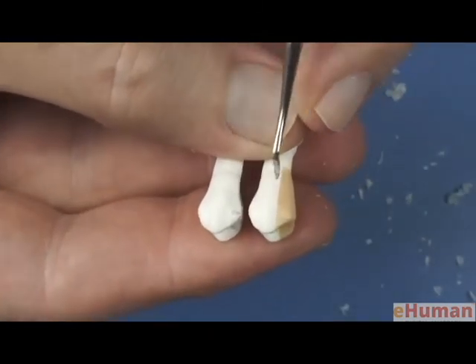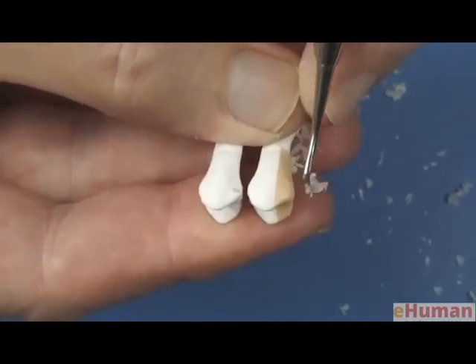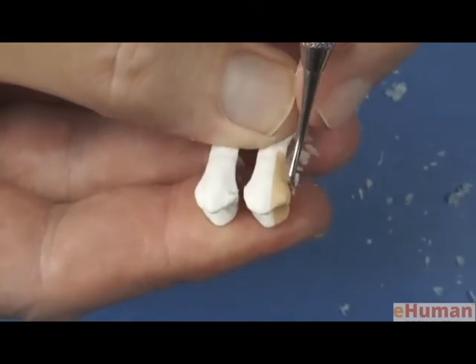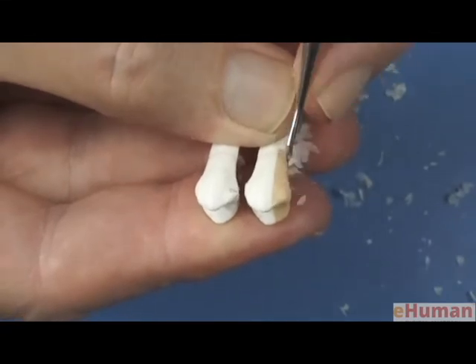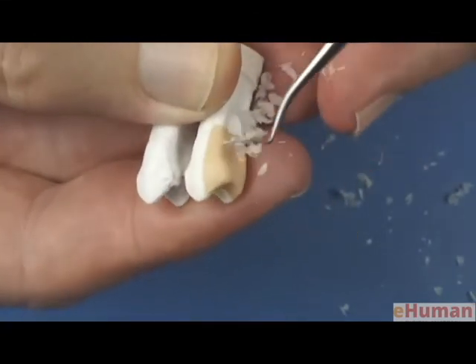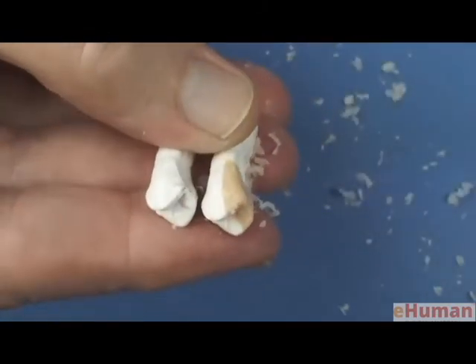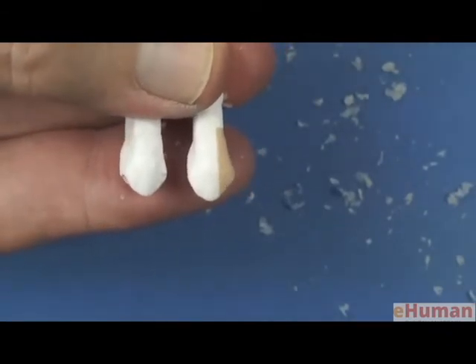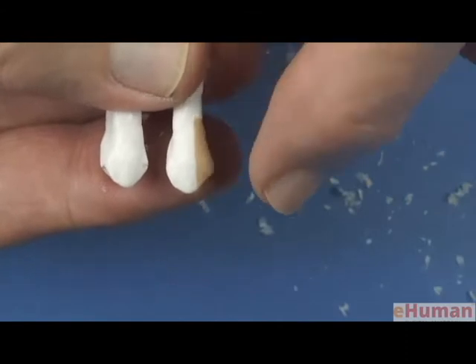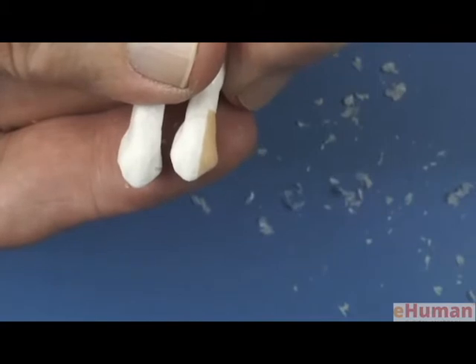Look at the curvature, the carving there, and then go to the other tooth, the waxed one, and carve. Look back and forth. Continually study the intact tooth and carve away from the waxed tooth. And you can see we're starting to now create the right shape as far as the concavity goes in that tooth. It's kind of hard to rotate the two exactly the same, but you can see we're now pretty close.